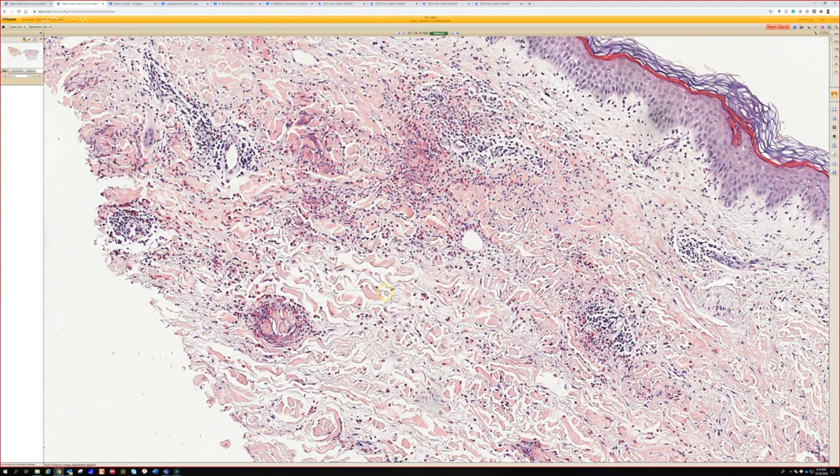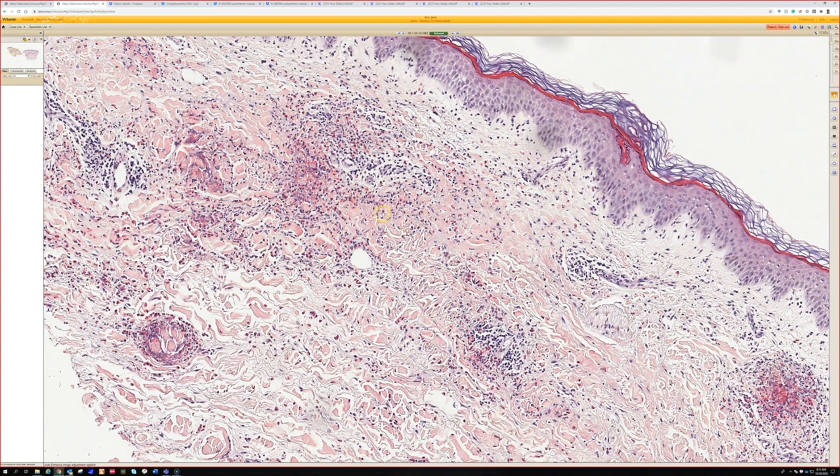It does require clinical workup to exclude other things. I've seen great flame figures in bug bites, really good ones. And there's also this entity, eosinophilic annular erythema (EAE), which some people think is an annular ring-shaped clinical presentation of Wells syndrome, and other people think it's different.